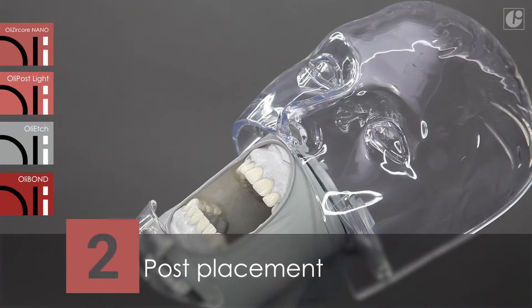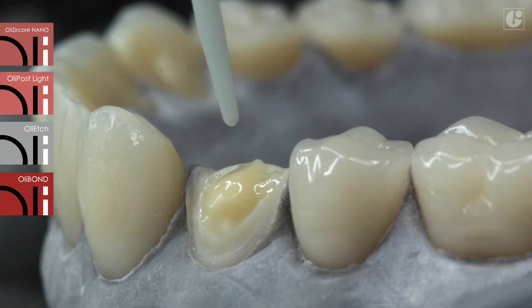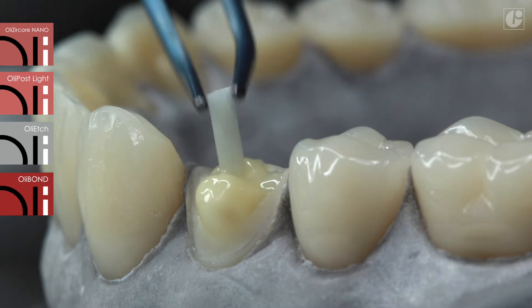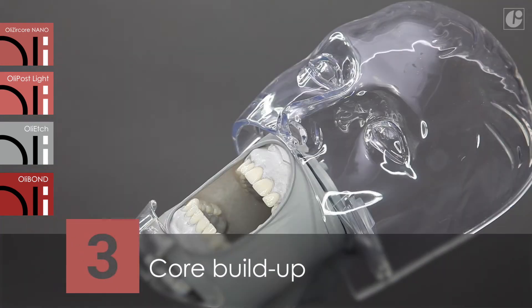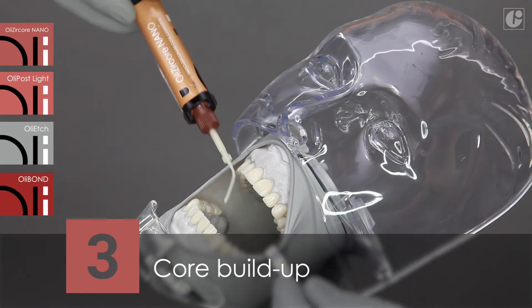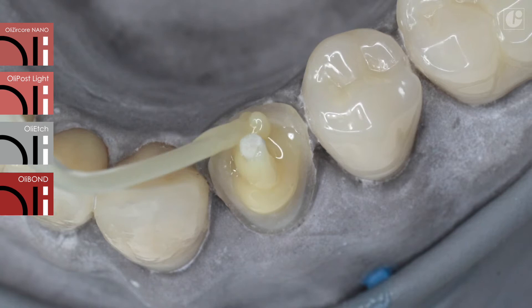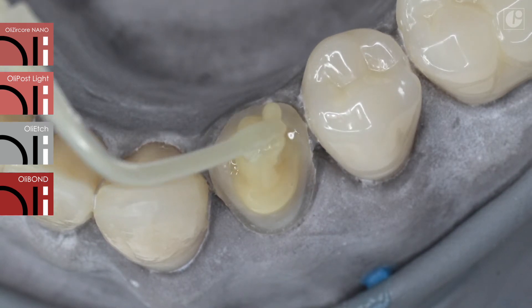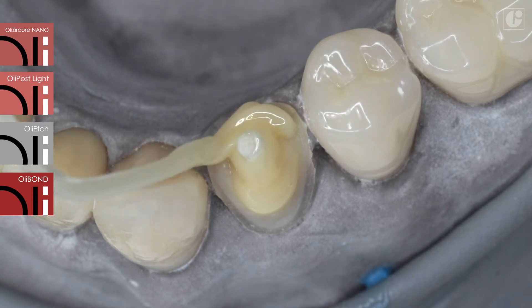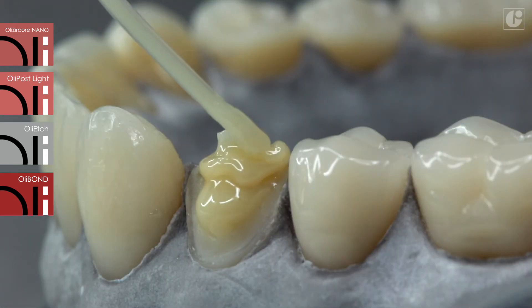A previously prepared OliPost Light needs to be placed inside the canal. Core buildup can begin immediately or after prior light curing of the outer layer of OliCircore Nano. It is worth paying attention to the perfect flowability and stability of the applied material. OliCircore Nano does not flow or drip, hence it allows precise buildup of the core.